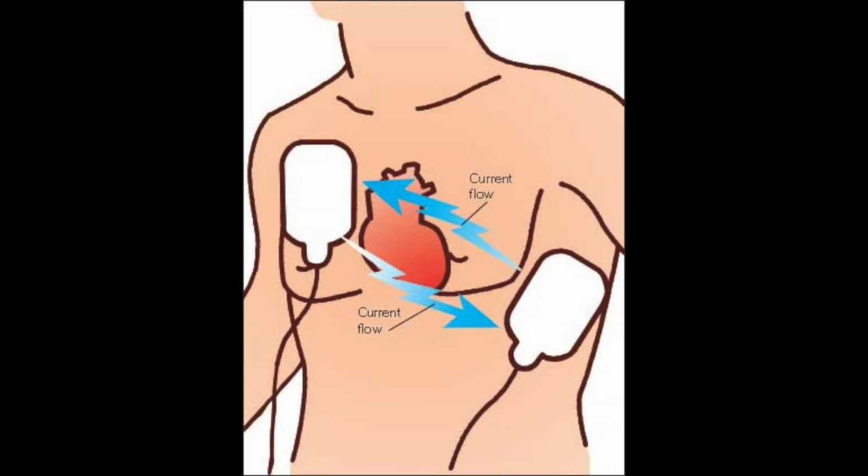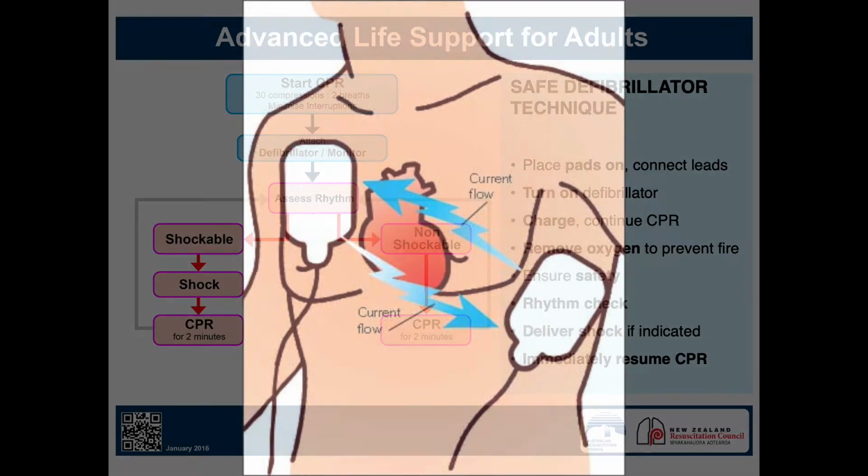Standard defibrillator pad placement is on the anterior chest at the right parasternal edge, over the second intercostal space, and in the axilla at the mid-axillary line over the sixth intercostal space. Alternatives include a biaxillary or anteroposterior configuration. Ensure good contact with the skin.